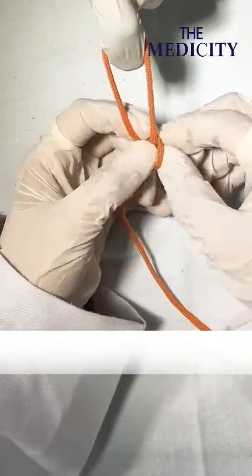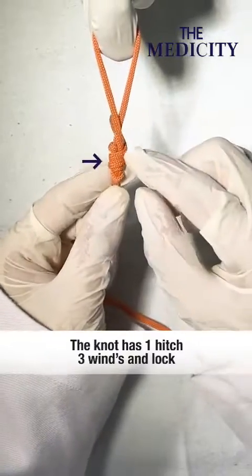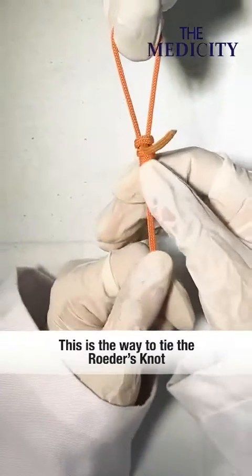Now we can take one more half lock with the longer one. Now we can see the knot: one hitch, three winds, and one lock. So this is the way how we have to tie this knot.